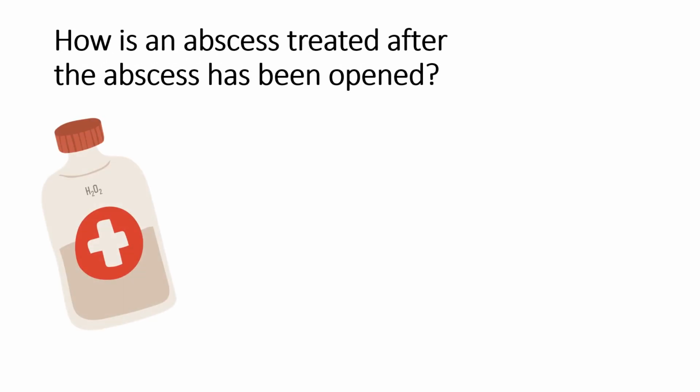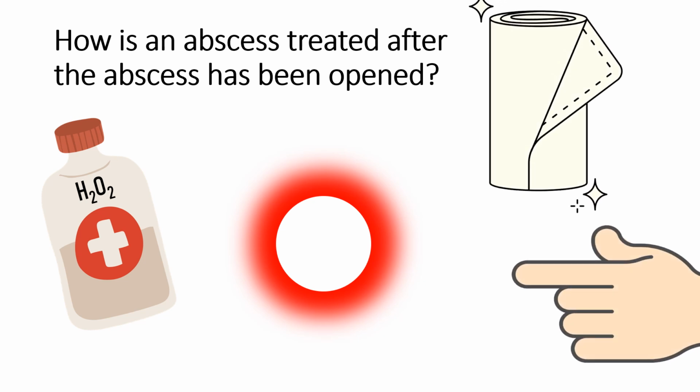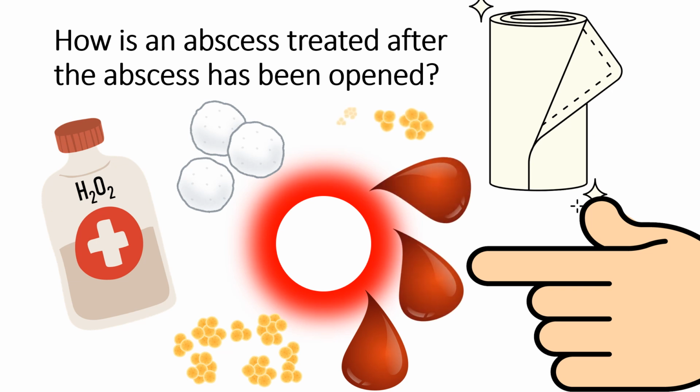After opening the abscess, pus and detritus, the stringy tissue are removed with a finger and napkins soaked in a solution of hydrogen peroxide. The existing bleeding, which in most cases is insignificant, is stopped. The venous bleeding is stopped by pressing with a gauze ball or tight tamponade of the abscess cavity. Tampons are inserted vertically into the wound.